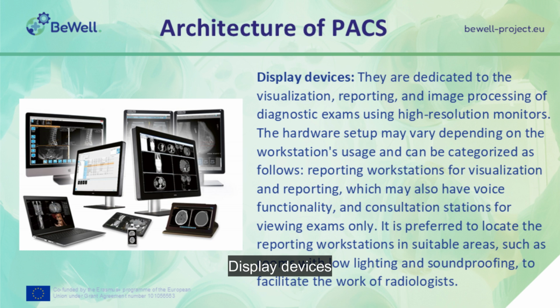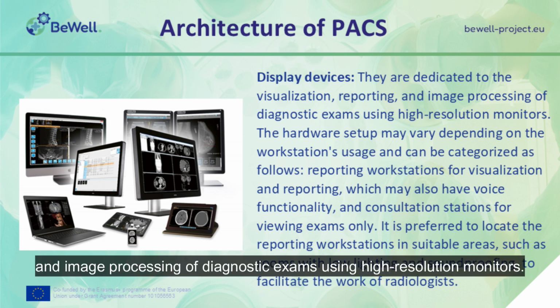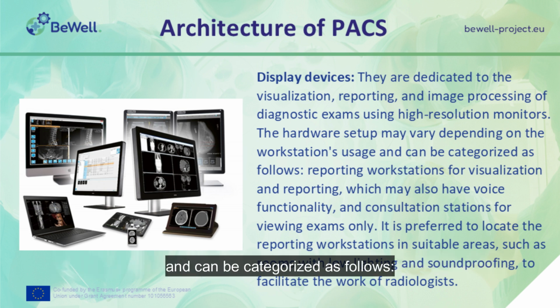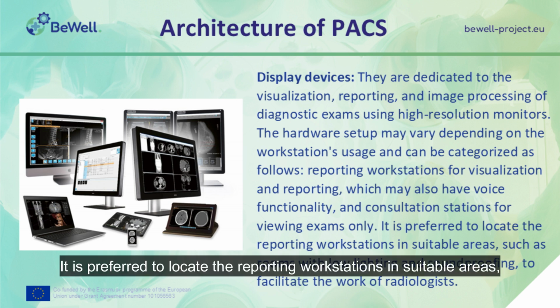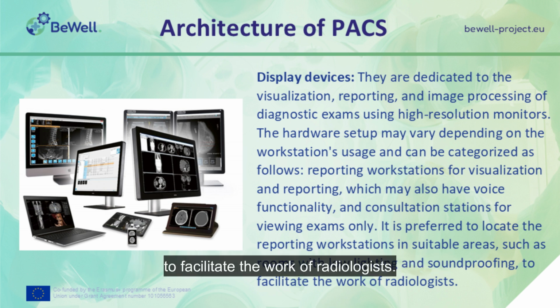Display devices. They are dedicated to the visualization, reporting, and image processing of diagnostic exams using high-resolution monitors. The hardware setup may vary depending on the workstation's usage and can be categorized as follows. Reporting workstations for visualization and reporting, which may also have voice functionality, and consultation stations for viewing exams only. It is preferred to locate the reporting workstations in suitable areas, such as rooms with low lighting and soundproofing, to facilitate the work of radiologists.